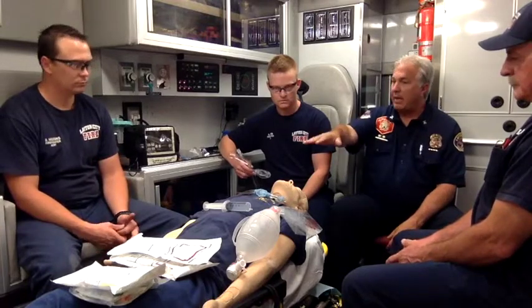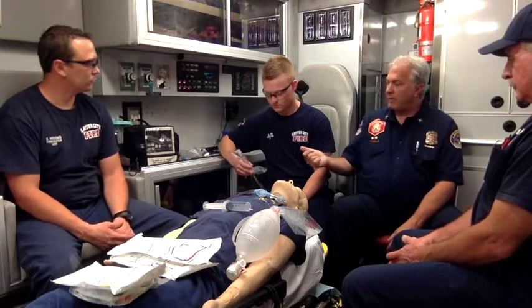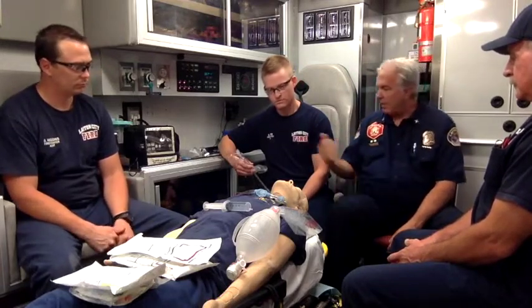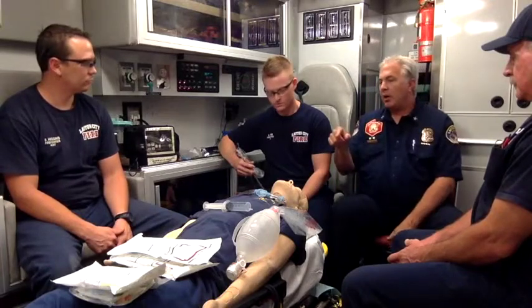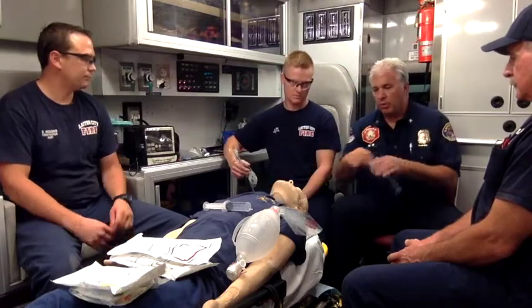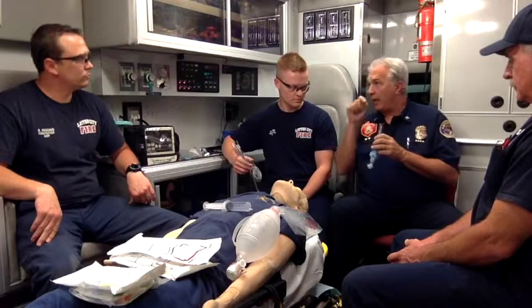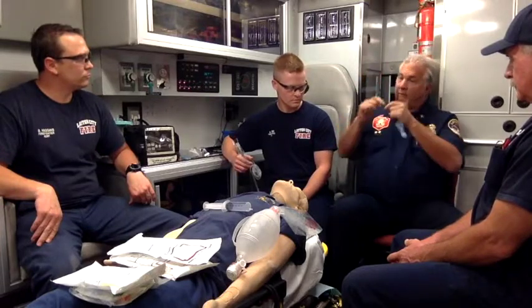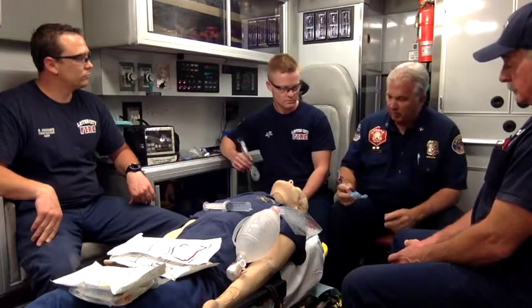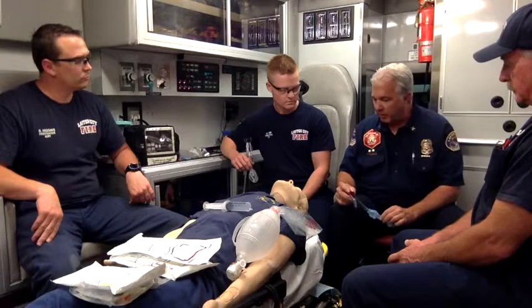So we carry in the paramedic equipment, in addition to the Kings, LMAs for the small patients that we may or may not use one of these with, and we carry this ILMA, the advantage of which is you can't intubate through the Kings. We can through that one, and in fact, if you look at a lot of the current literature now, there was a notion that I could run a bougie through this back port, run it up through the front, and then retro this thing back off and retro an ET tube over the top of it. And we actually even taught that in the difficult airway course for a while. Now they're advocating not doing that whatsoever. In fact, I said that wrong. It's through the main port.